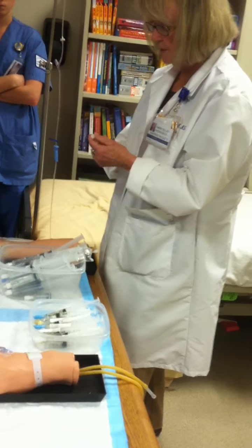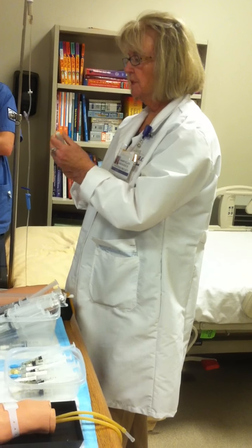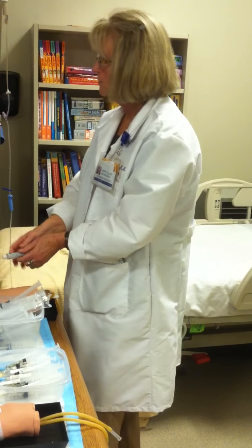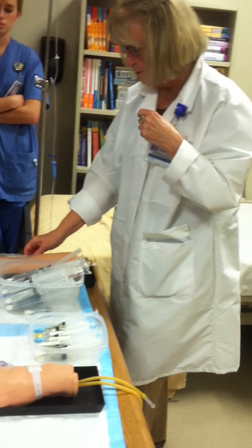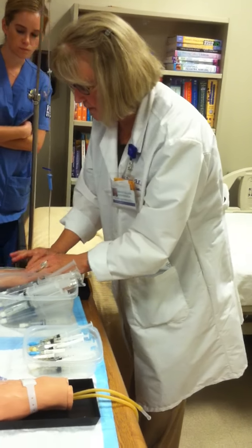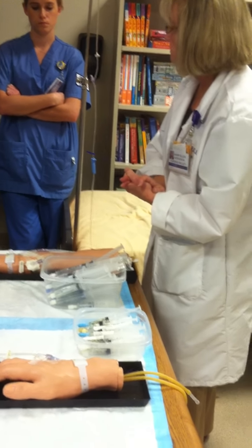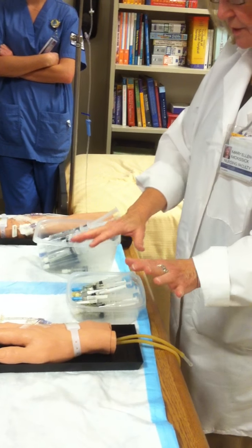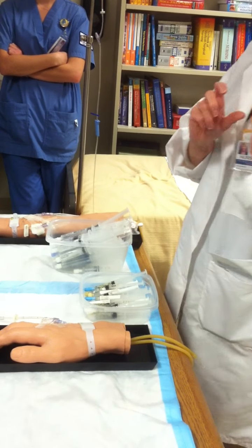A lot of them, you won't actually have a needle on the syringe end because it's a needleless system. But if it is a needle, do the needleless release and put it in a sharps container. If there's an IV already running and the IV site looks okay, you don't need to do a flush before your meds. Unlike a saline lock where nothing is running — you can't be sure it's still in the vessel, so that's when you need to do the flush.